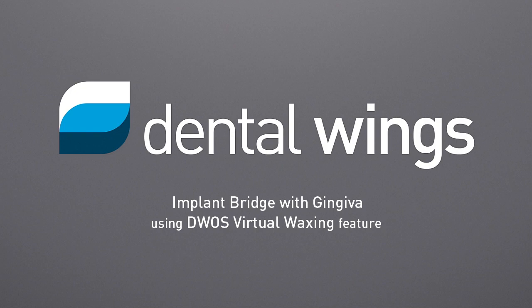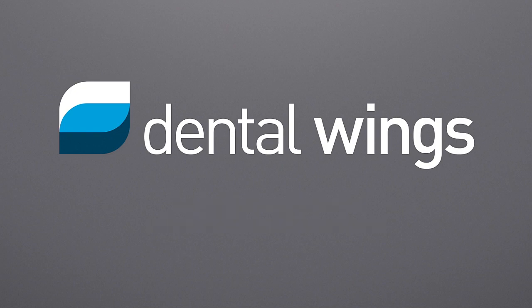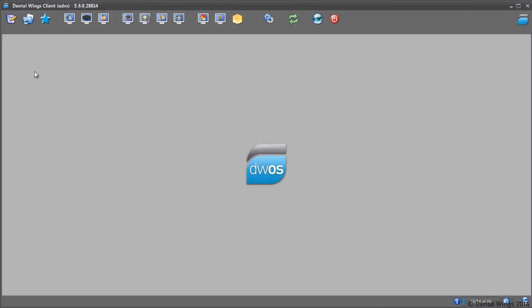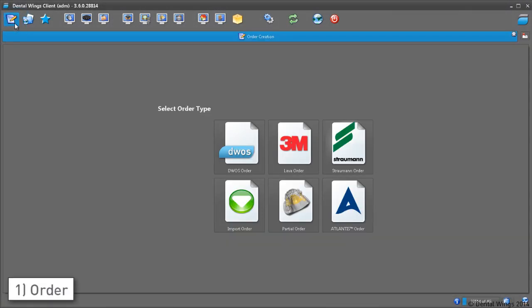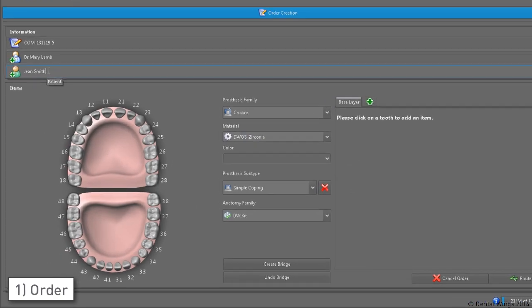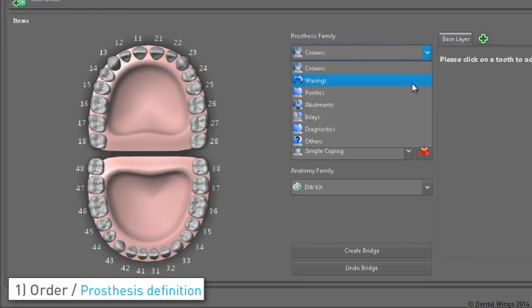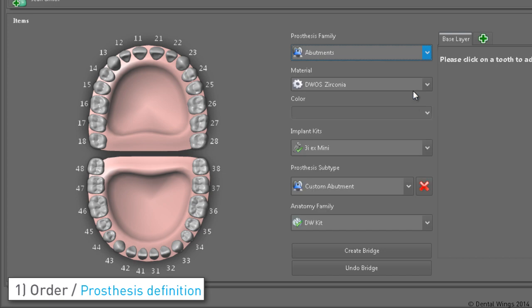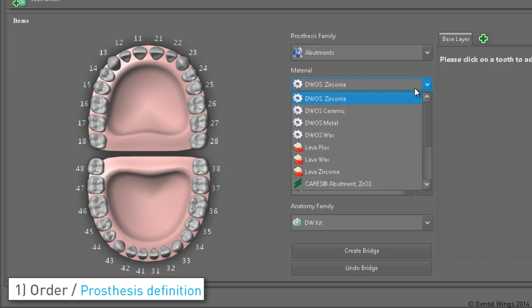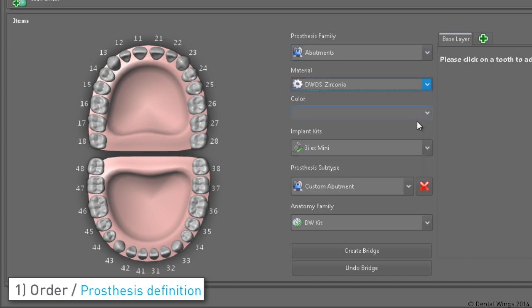Hi everyone and welcome to this video tutorial on how to design an implant bridge with gingiva using the virtual waxing feature of DWOS software. We're going to start by creating a regular DWOS order. Once the dentist and patient are assigned, select abutment as the prosthesis family and the desired material for the final restoration.